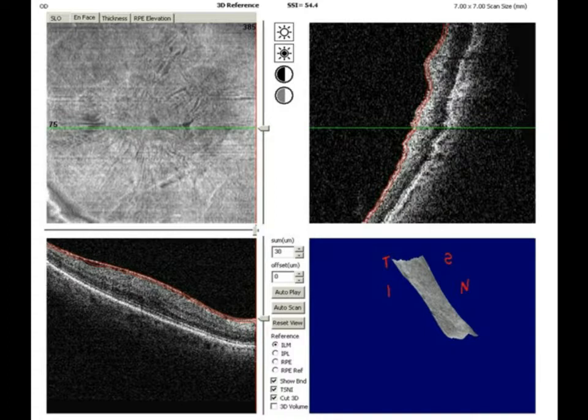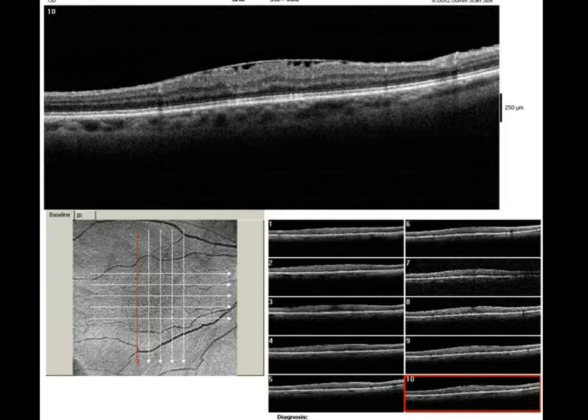See, these patients were in our practice, but they were simply being undetected. And you can go through any portion of the retina. Again, this is just another scan, a vertical scan through that same patient, but you can go through any scan in the macula and determine what's causing the decrease in best corrected vision. Again, these are individuals that we sometimes blame early cataracts for reduced best corrected visual acuity, or other issues we're trying to explain this with. But with an OCT scan, this really adds a certain level of definity to the diagnosis.